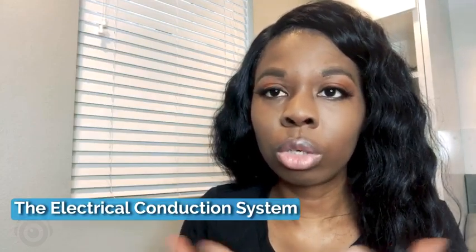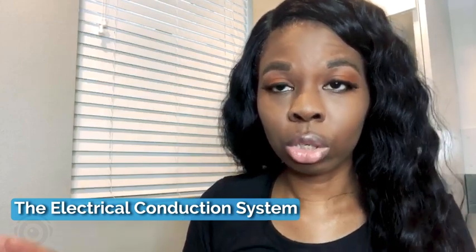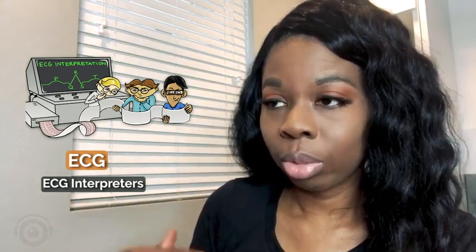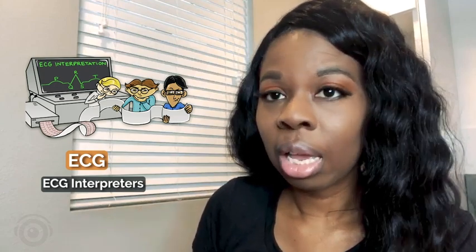So the first thing, number one, is that you got to first learn the electrical conduction system, because that is pretty much the system that will help you to understand the purpose behind EKG strips. It will help you to understand how to interpret it, and it will honestly help you understand the basic role of it. That's going to make a world of a difference so that you can really know how to interpret EKGs.